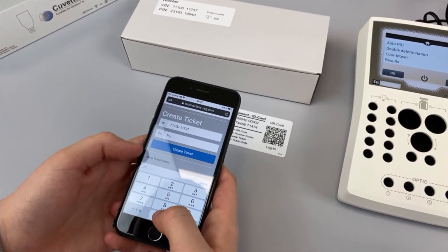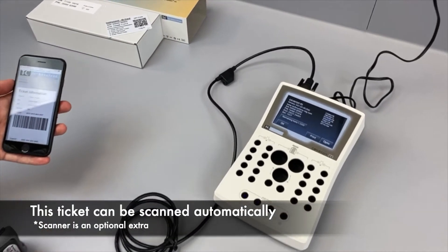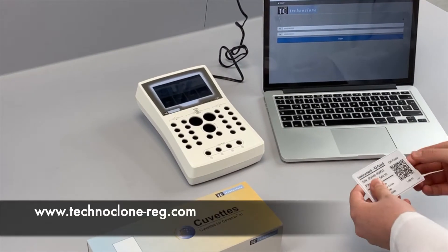The created ticket information is then entered into the instrument. The validity is indicated on the screen and the cuvettes are automatically loaded to the instrument.